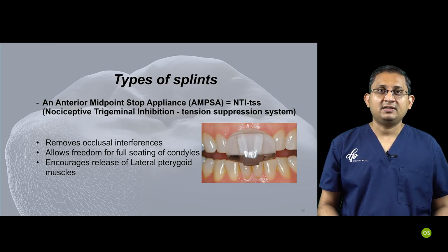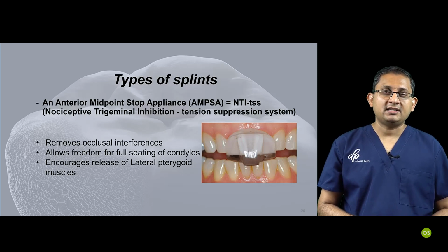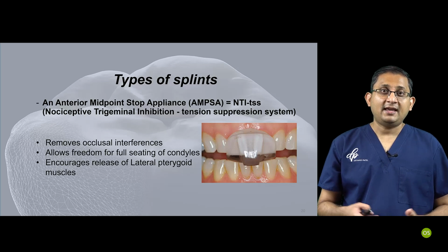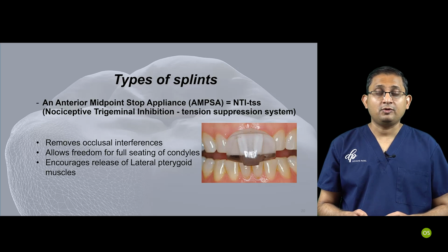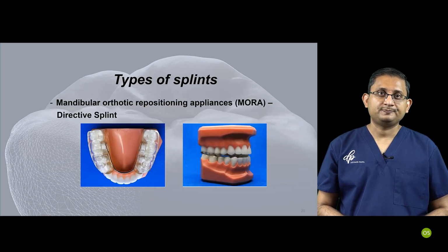You could use them as a deprogrammer. However, I particularly don't use them for nighttime use. However, if the patient cannot really cope with the Michigan splint, then you might want to look into alternative options.